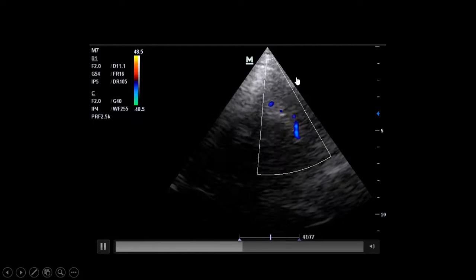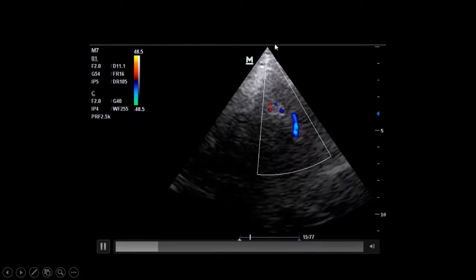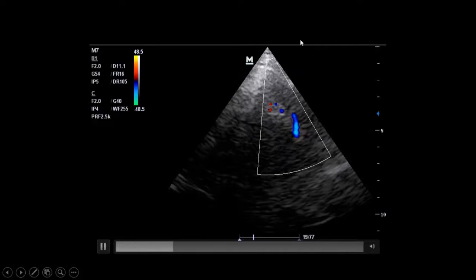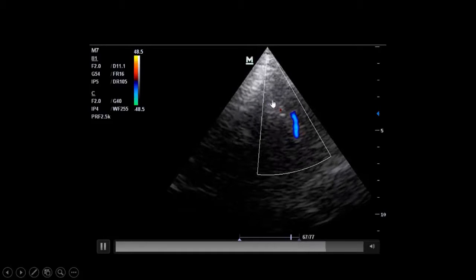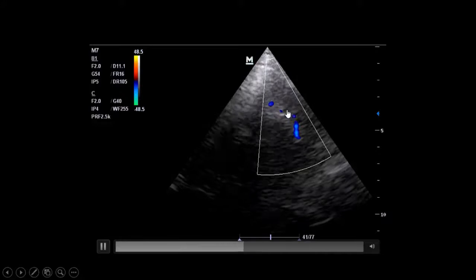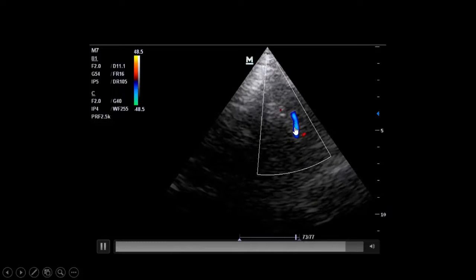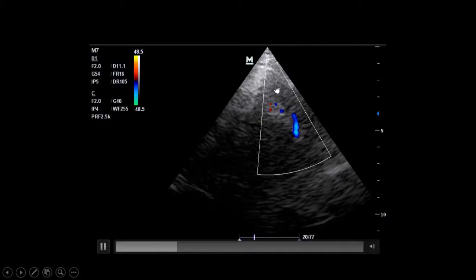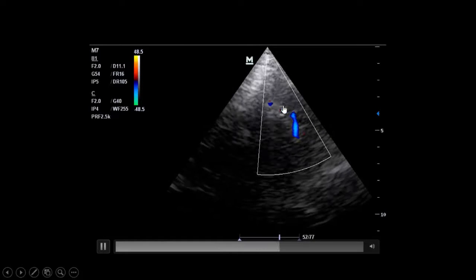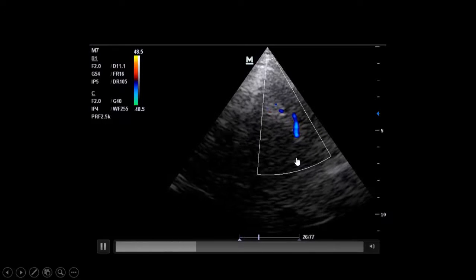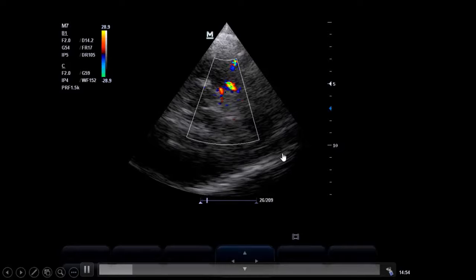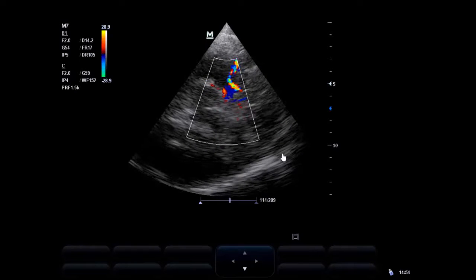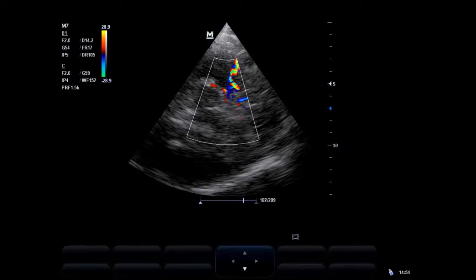Here is the right side anterior cerebral artery. With the probe in the temporal region on the right side — posterior, anterior, lateral, medial — you can see the right anterior cerebral artery going in blue, away from the probe. It travels from lateral to medial, appearing in blue — a very clear view of the anterior cerebral artery.